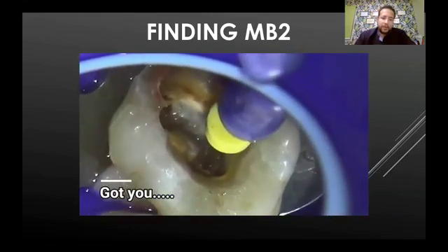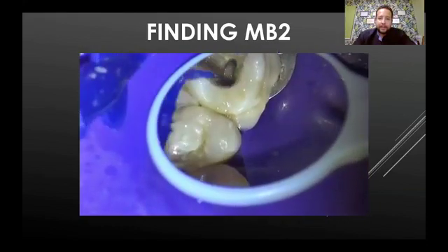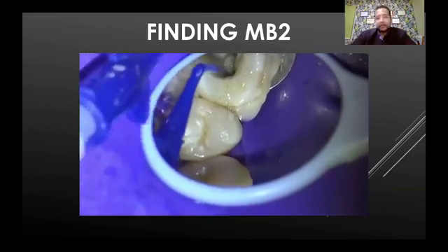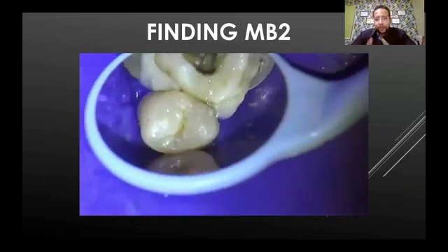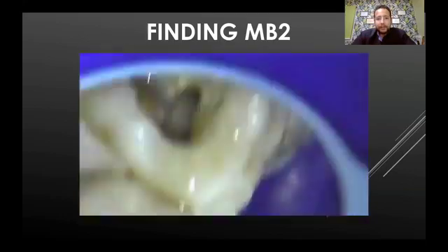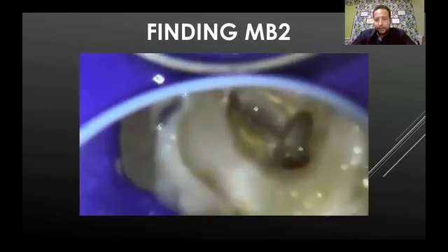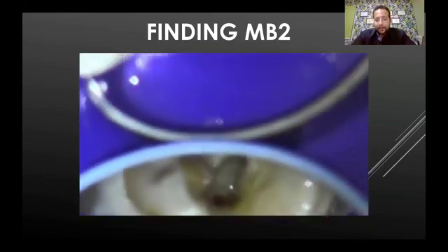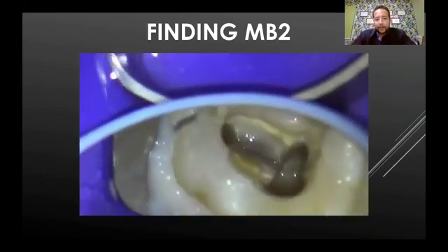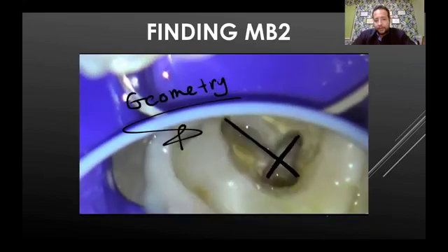We're also going to review the geometry and the dentine map after shaping. Look how close the MB1 and the MB2 are. It's not always the scenario, but it's mostly the scenario that the MB2 and MB1 orifices are very close to each other, but we're going to see a case where they are far from each other. Now we can review the geometry and the dentine map.